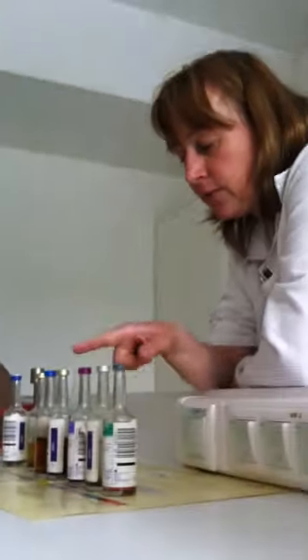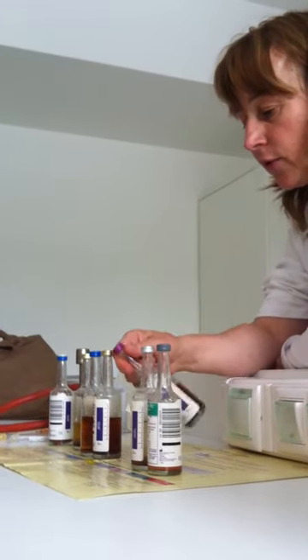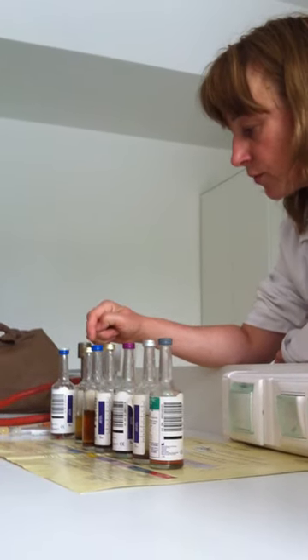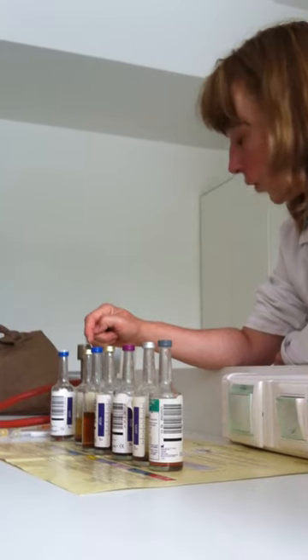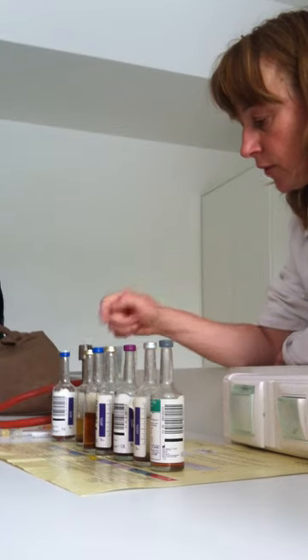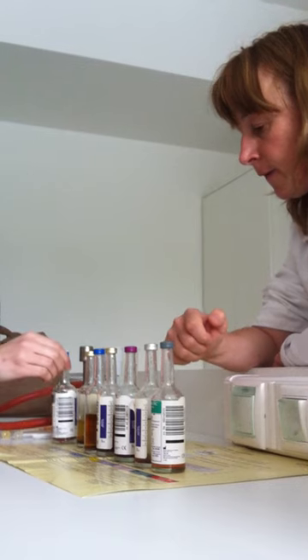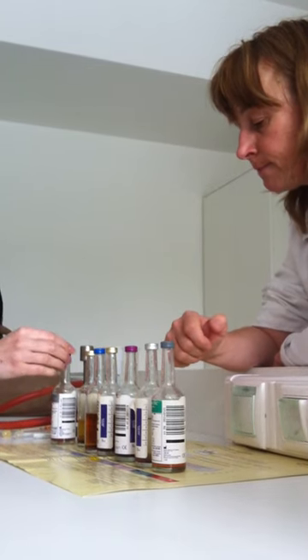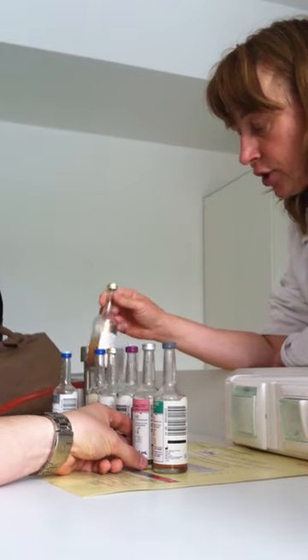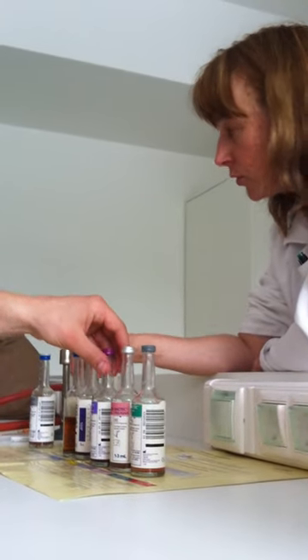And you should disinfect the surface of the bottle as well. You can see this surface. Because there is a cap, you remove this cap and then you should disinfect with alcohol. Iodine is not appropriate here because it damages the material; this is not plastic, this is a special material. And during inoculation, while filling, you should gently shake the bottle. If not, the blood could clot.